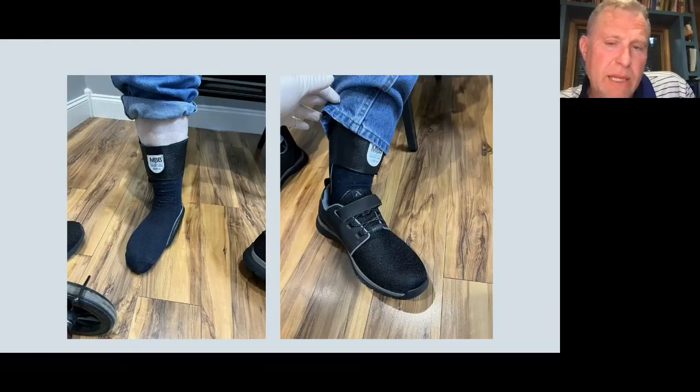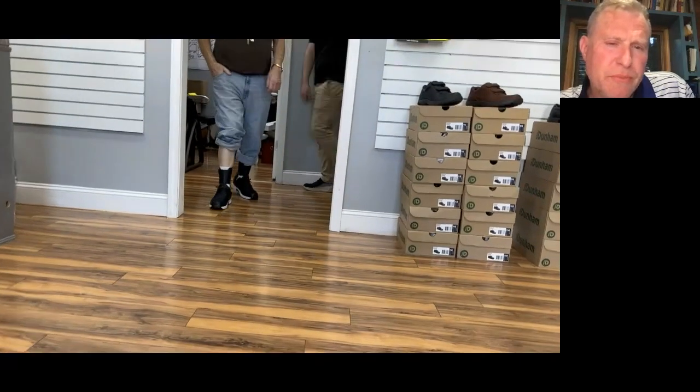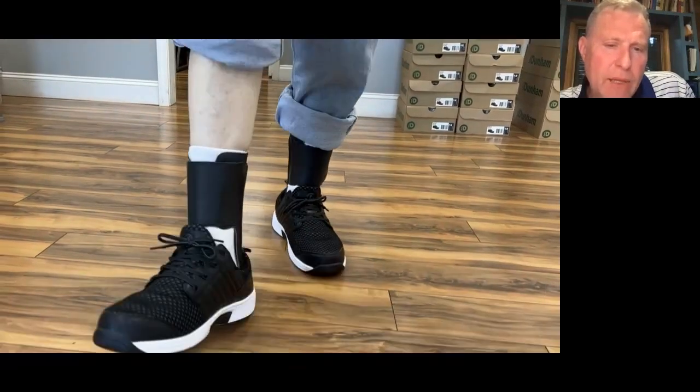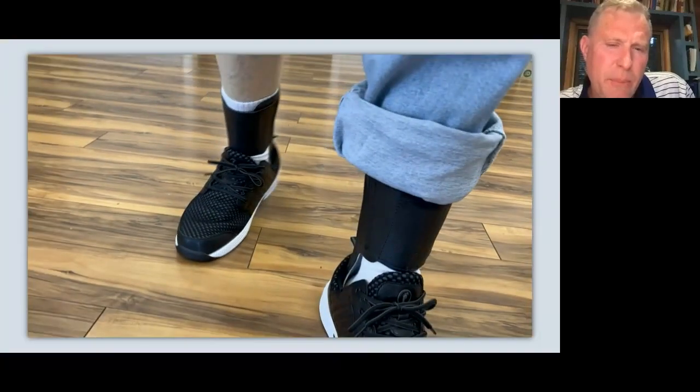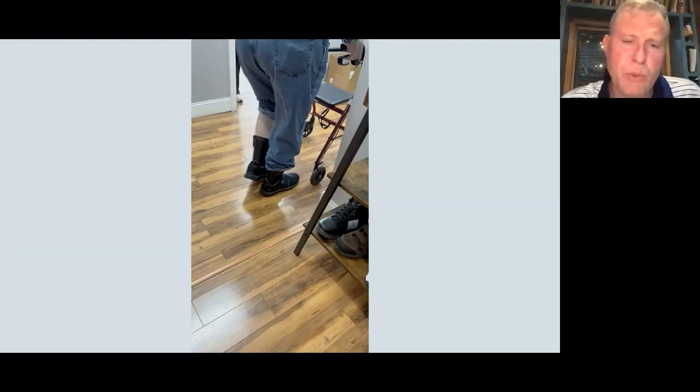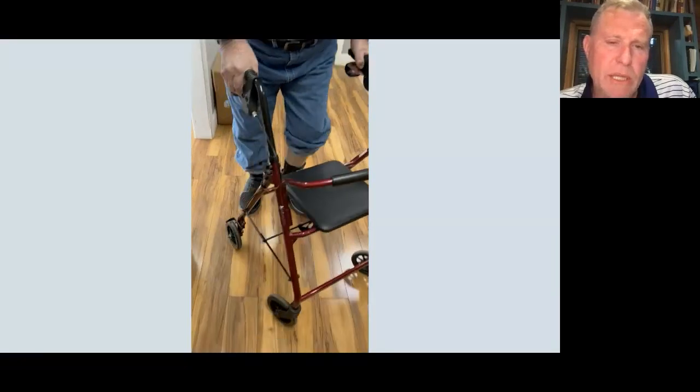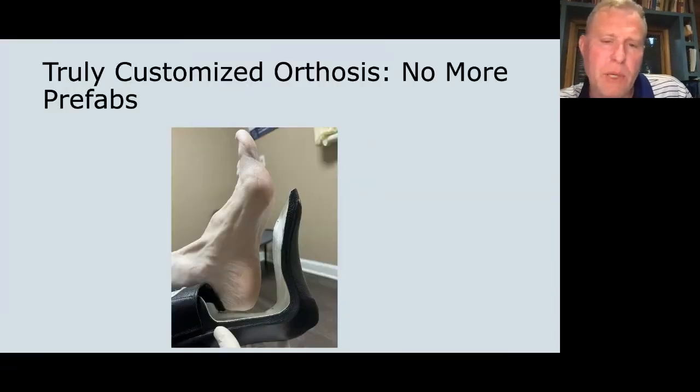And again, we're fitting these things with really good shoes. Notice how these patients are walking heel to toe. We're lifting their foot. They can't drag it as much. This is a patient in a new pair of shoes that we got for them. This is one of the Anodyne Velcro shoes, which I really like. This patient just picked these up. He's new to them. He doesn't have a sock yet that goes high enough. Of course, we get all these patients in socks. But again, watching them walk and then immediately feel that benefit is pretty awesome. But this is an example of how good these orthotics are that are part of the AFO.